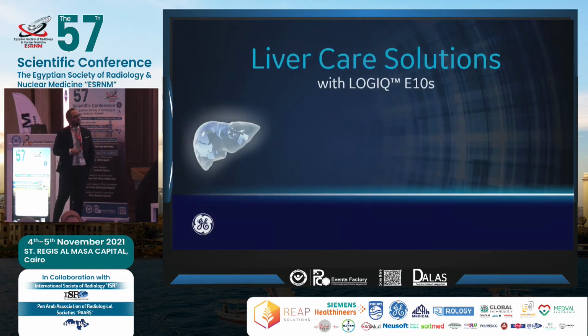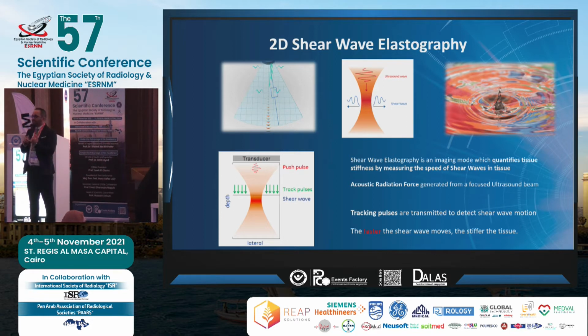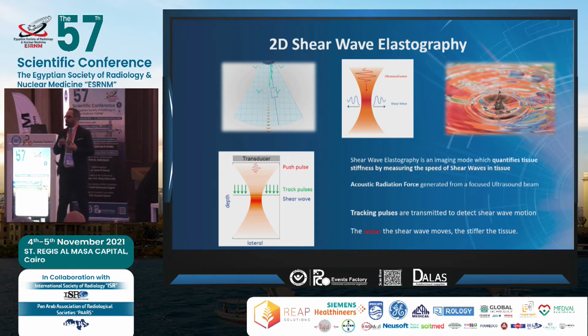With this, shear wave comes in. And with the launch of any new technology, we look at three important parameters. One is the physics of that technology, then the technique. Third, how we do interpretation.